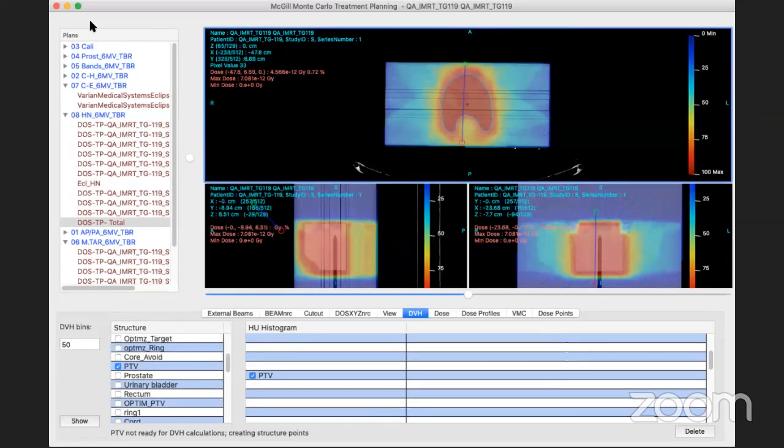Yeah, sure. There are a few things that I have. With Catalina, the compiled version does not work immediately. So I have actually fixed something in the code that I can probably share with your kit, so you can implement it in the newer version when you compile. Okay, guys, any other questions for Andrew?